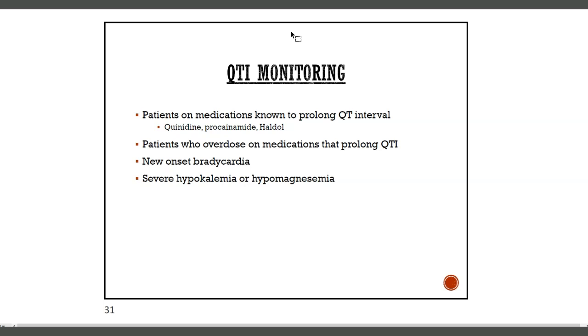Also, with certain patients, they may overdose on some medications, and overdosing can prolong the QT. Also, if a patient has a new onset of bradycardia, we want to monitor the QT. And patients with severe hypokalemia or hypomagnesemia can actually develop QT prolongation.